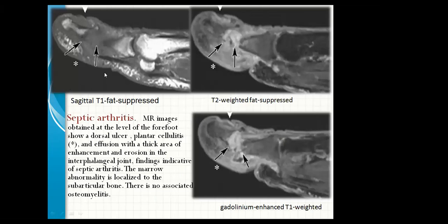Septic arthritis. MRI imaging obtained at the level of the forefoot shows a dorsal ulcer and plantar cellulitis with a thick area of enhancement and erosion in the interphalangeal joint — findings indicative of septic arthritis. The marrow abnormality is localized to the subarticular bone. There is no associated osteomyelitis.